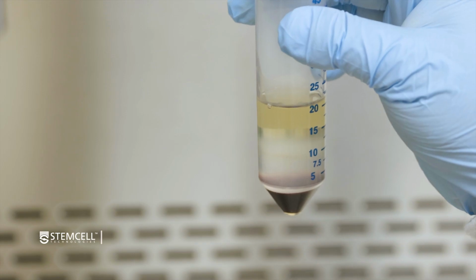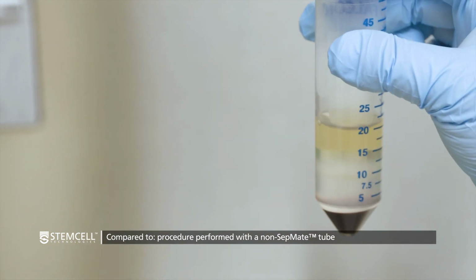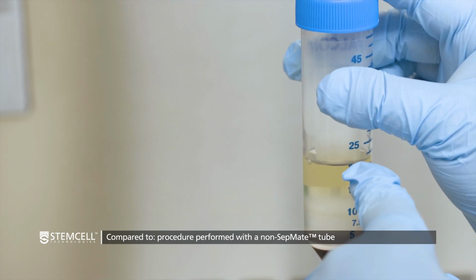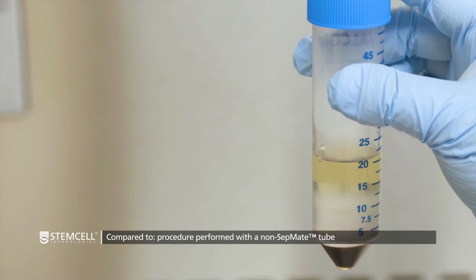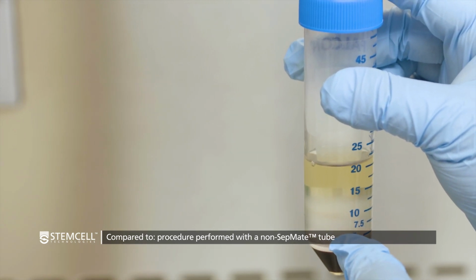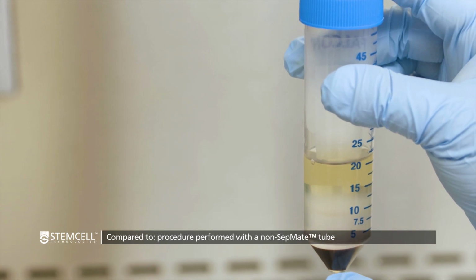Okay, so here you have the tube coming out of the non-SepMate spin. And you'll notice that at the very top, very similar to your SepMate, you're going to have some diluted plasma. That's the yellow layer. Then you're going to have this fuzzy white PBMC layer. Just below that, you're going to have some density media. And then just at the very bottom, you're going to have your red blood cell granulocyte pellet.